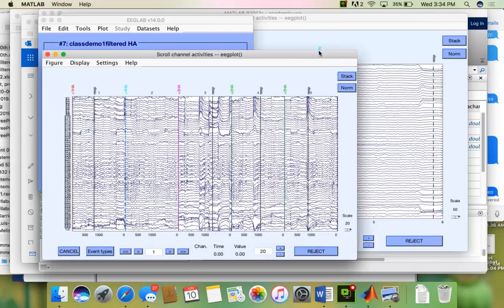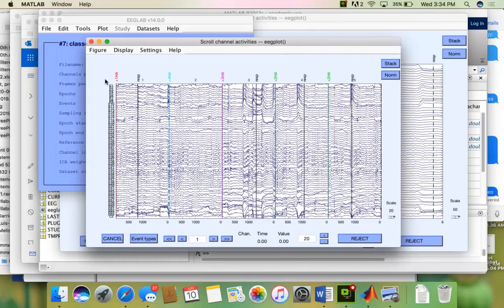I have here on my figure, here's the presentation of happy avatar number 1. It's going to record for 2 seconds. And by the way, the 0 did work, so that's good. So it starts right with the presentation. It records for 2 seconds. You can see the response here. So I'm actually recording data before and after they respond. Sometimes that's an issue because sometimes after people respond, they take a breath, sneeze, cough, move their head, blink their eyes, etc. And you can see some of the time there is associated with this response a little movement.